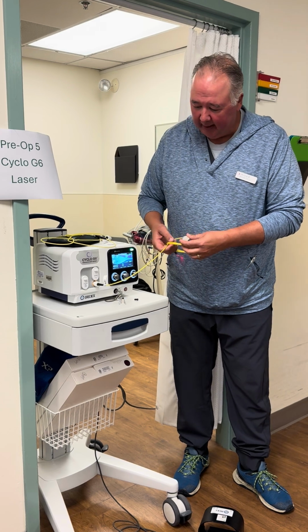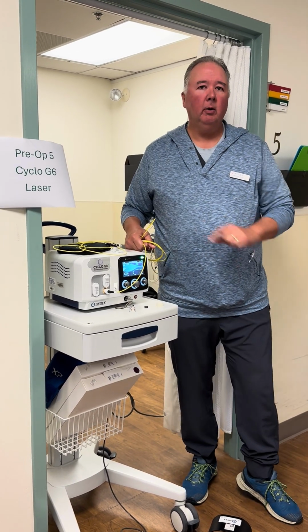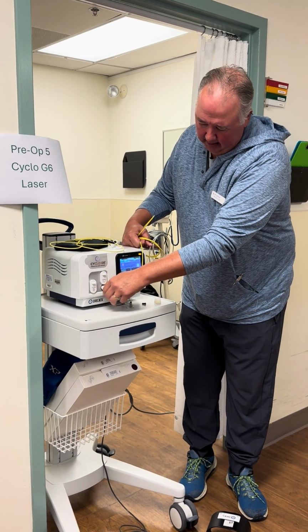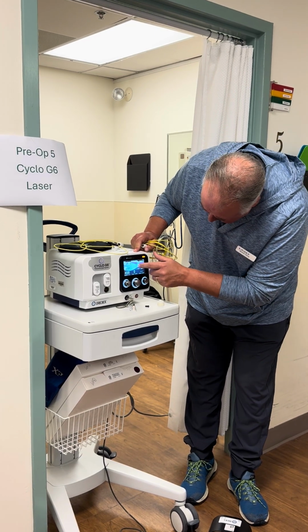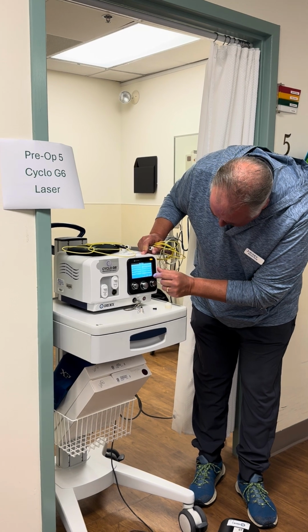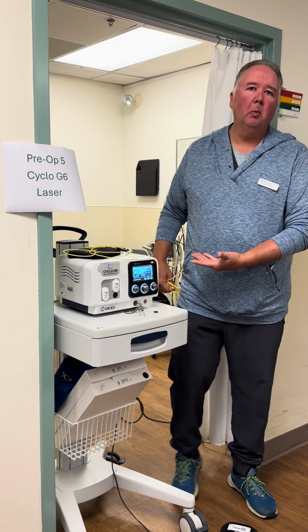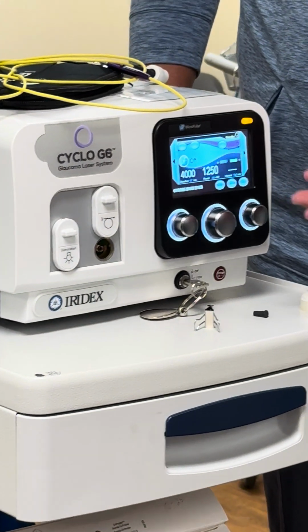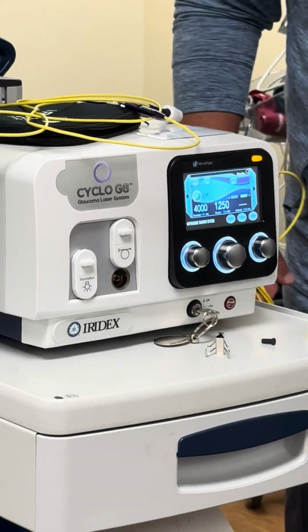These demo probes, like I said, don't have the powers dialed in when they're hooked up. Let's see if we can get it to show up though. So, preset, dark eye, I'm going to view. So here is the normal preset. So it would be 4 seconds at 12.5 or 1,250 milliwatts. That's just the power.